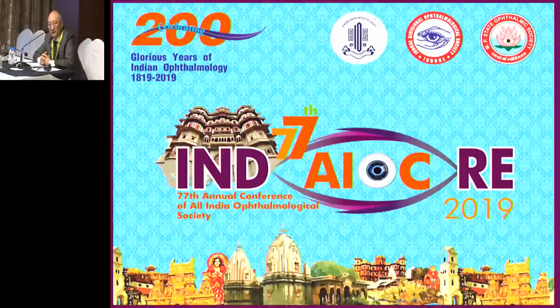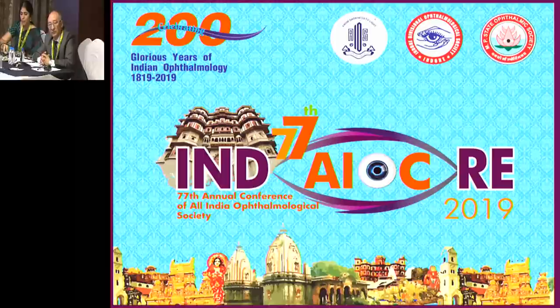In IOL delivery systems, there have to be modifications, and they will keep happening in the future also. We'll have an injector which can go sub-2 millimeter very soon, and very effective management of cases with astigmatism. Toric IOLs are now available up to 4 diopter correction. They will be available for a higher degree of toricity in the cornea also.